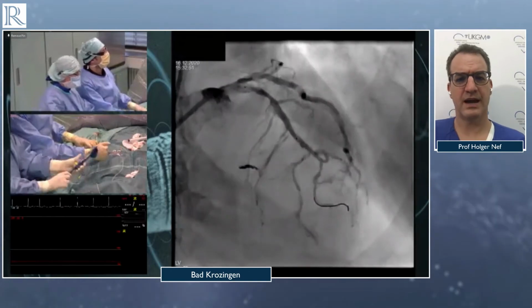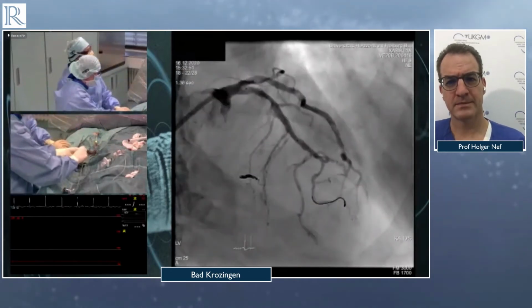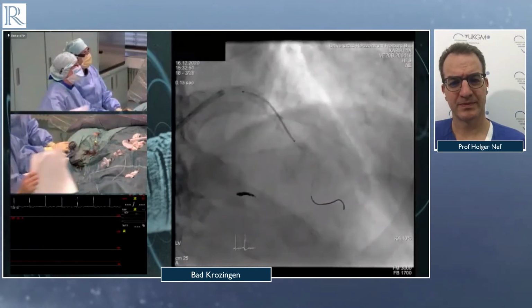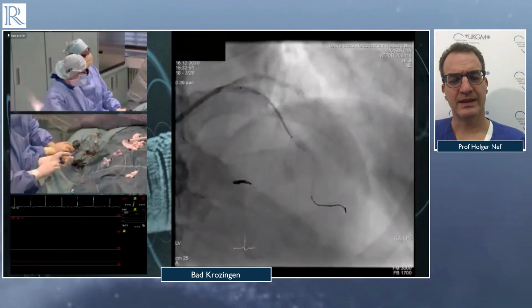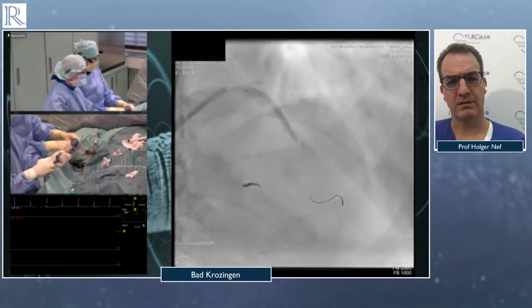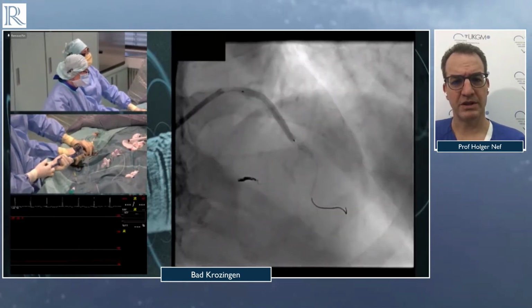How does it feel after you have? Very easy. Open? It's very easy? Just straightforward. I could go very easily inside. Okay, and you can go. Yeah. Well, in this case, Candice and Marek, you have brought down the IVL balloon very easily.